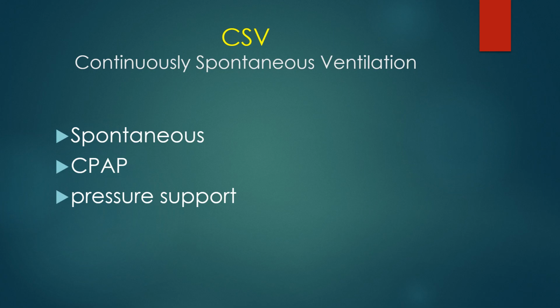We do use spontaneous on the ventilator occasionally, or CPAP, where the patient is not getting anything from the machine, he's just breathing spontaneously. We use that pretty much only to do a spontaneous breathing trial.